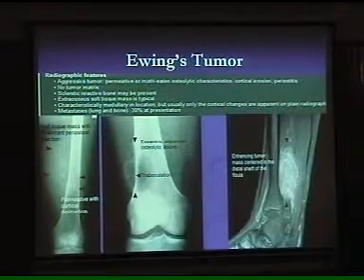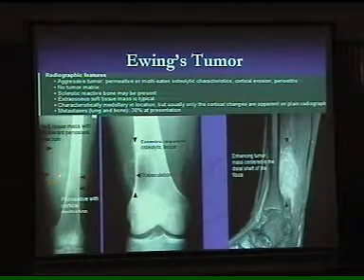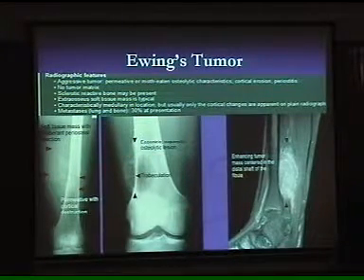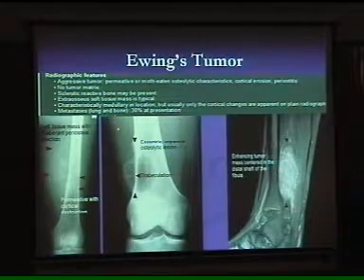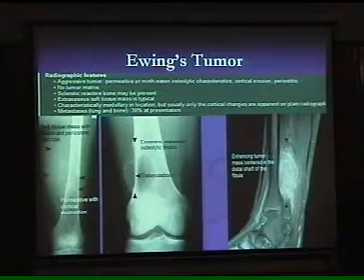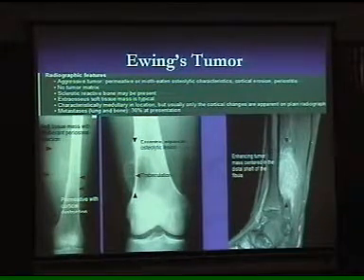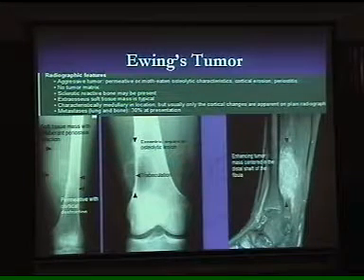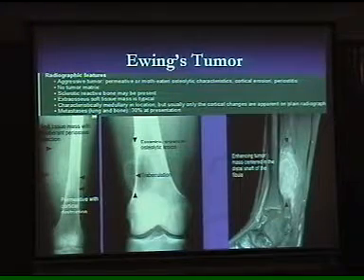The presentation is exactly the same: high grade temperature, pain at the site of the complaint area. But if you look at the fascial planes, they are pushed but they are not lost. Look at this soft tissue shadow over here, that is preserved. In cases of acute osteomyelitis, the first thing is the bone change may not be so evident, but the first change is loss of soft tissue muscle planes because of the edema formation that gets lost.